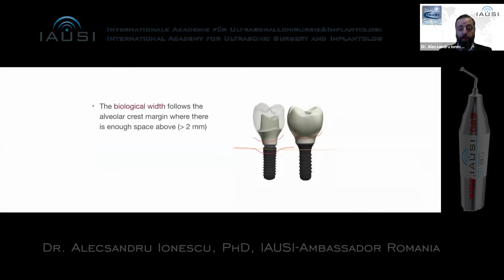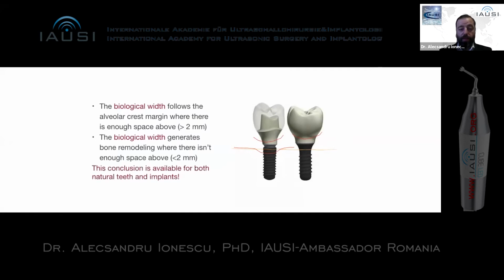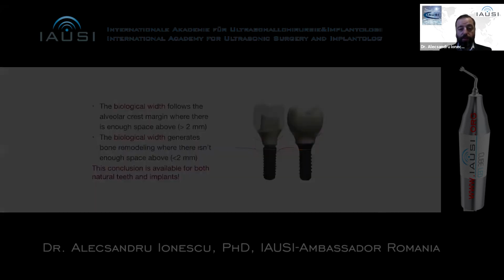A short comparison between the tissue level implant and the bone level implant in terms of prosthetic parts, such as we will be able to describe it in the next cases. And we have this biological width concept both around implants and natural dentition.